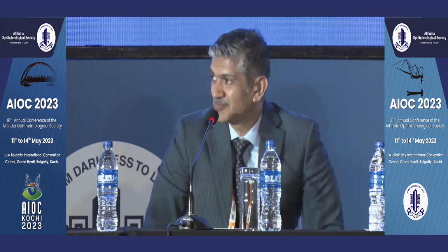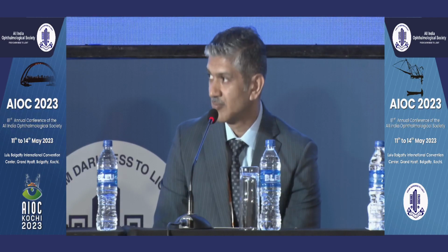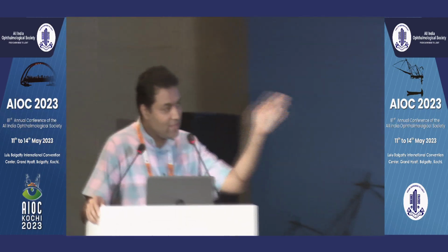And like I said, your excellent work on SMILE Xtra, when we started doing this, where we did a randomization, it exactly proves what you have written in your discussion, that it biomechanically changes, and this is a proof. Whatever we say, we need proof, and the proof is when you see this image, like I showed, the orientation completely changes.